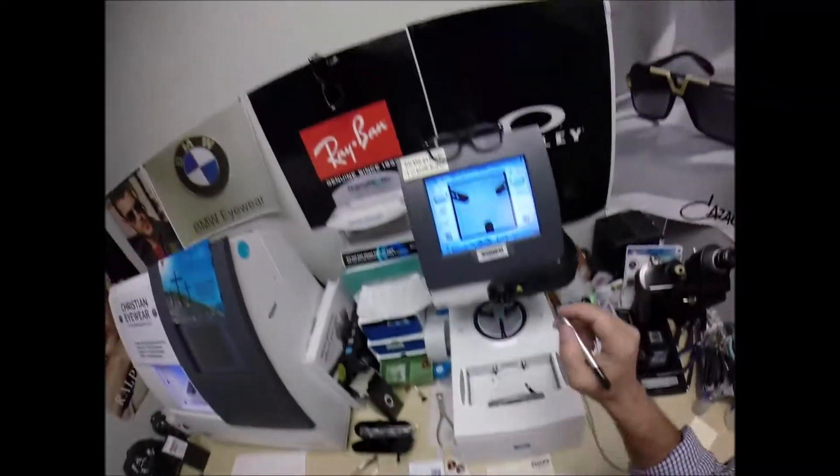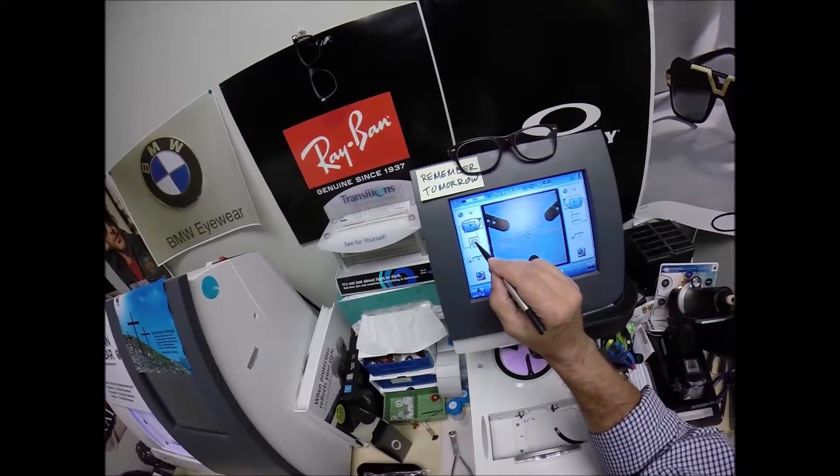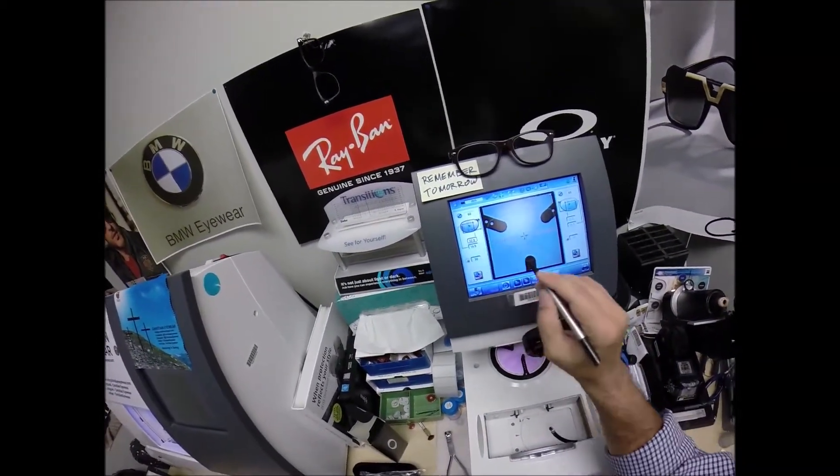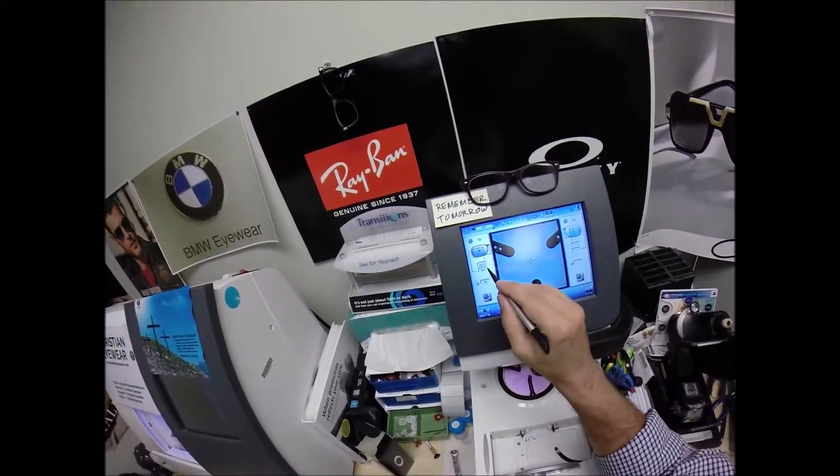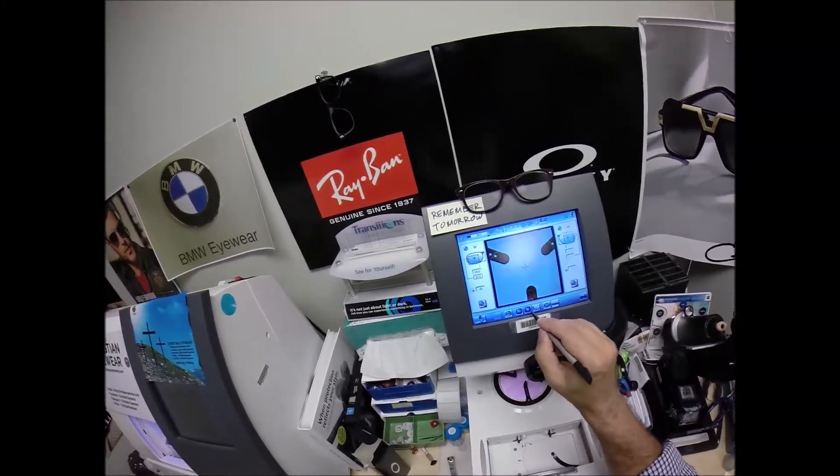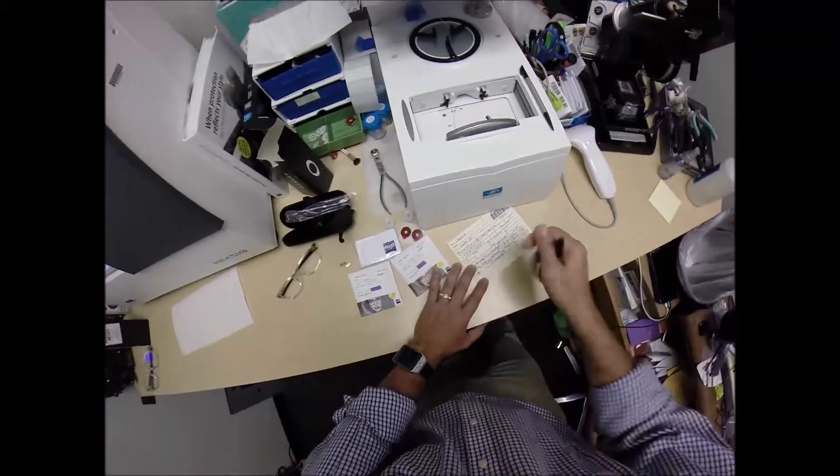I need to enter your pupillary distance of 68. The computer, which divided by 2, is 34. I'm going to tap the plus button until we get to 34. I'm going to raise the optical center height up to 22.